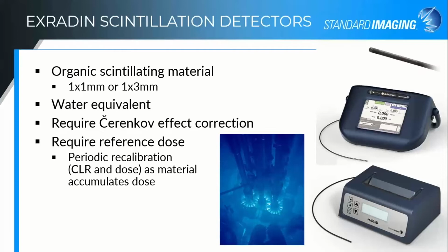This is also not a calibratable detector that you can send off to the calibration lab and have it come back with a cal factor that's good for 3 years. It's a material that degrades as it's dosed. I'm sure all of you have seen old PMMA phantoms, the clear plastic phantoms that have turned yellow as they've received dose.